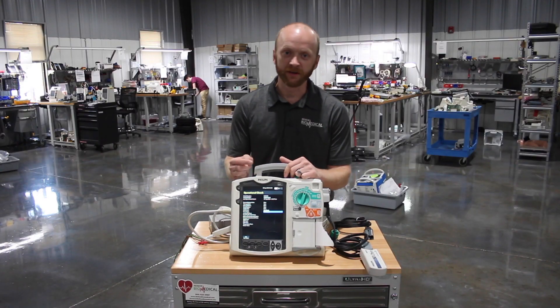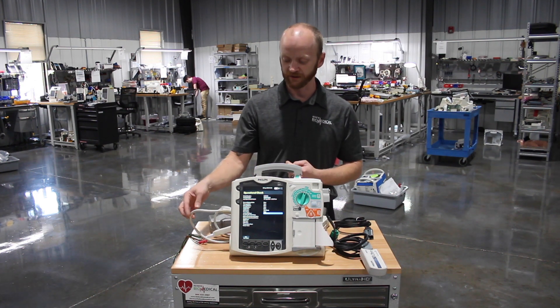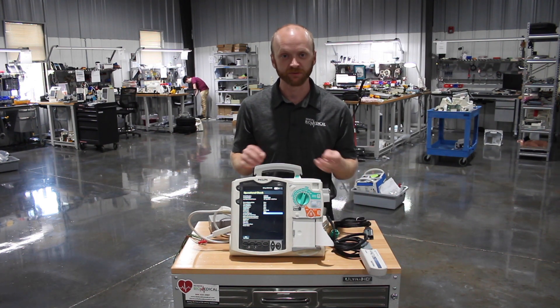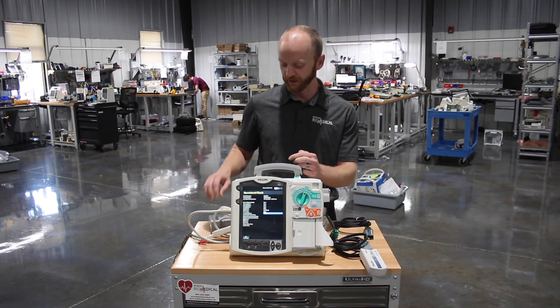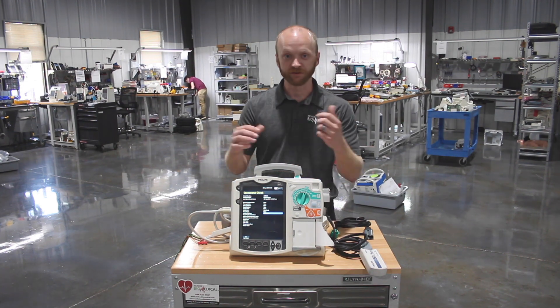Here at Renew Biomedical we still stock the parts and service these as well. We still have the accessories, the therapy cables, we stock batteries, we have the AC power supplies as well. Give us a call.